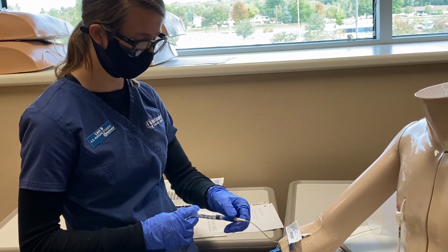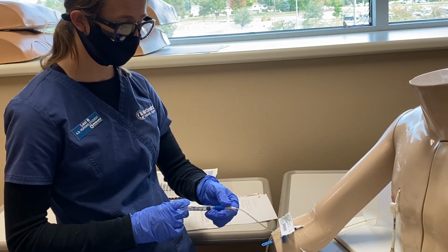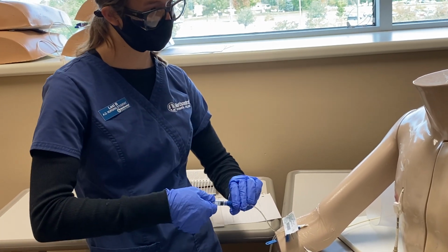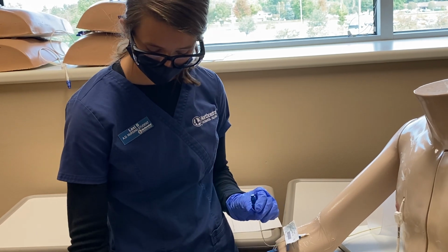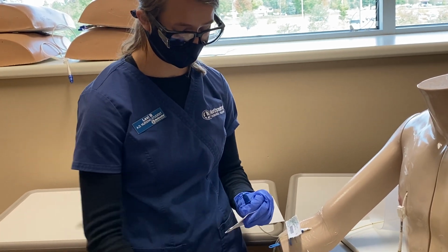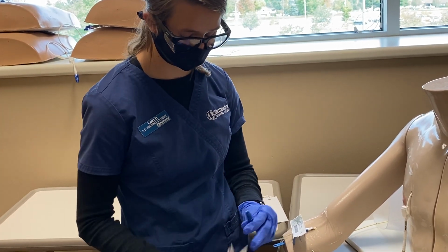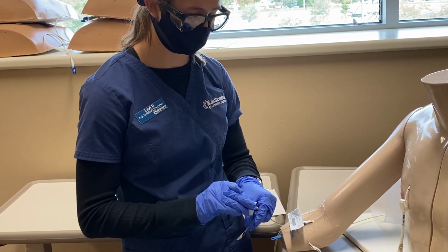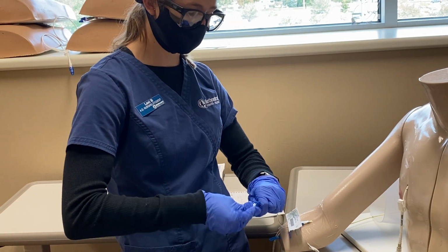Due to time purposes, I'm just going to speed it along. Are you feeling okay, Mr. Owens? He says he is. I'm going to grab another alcohol wipe. Cleansing again for 15 to 30 seconds.